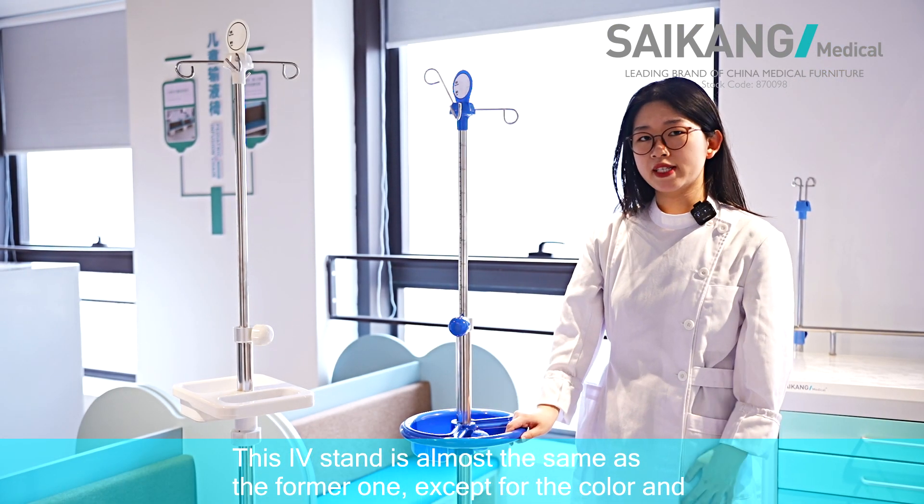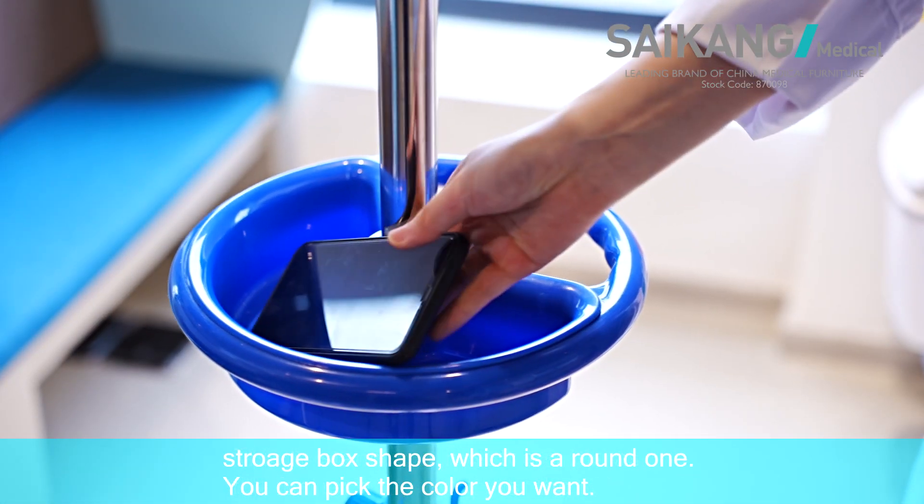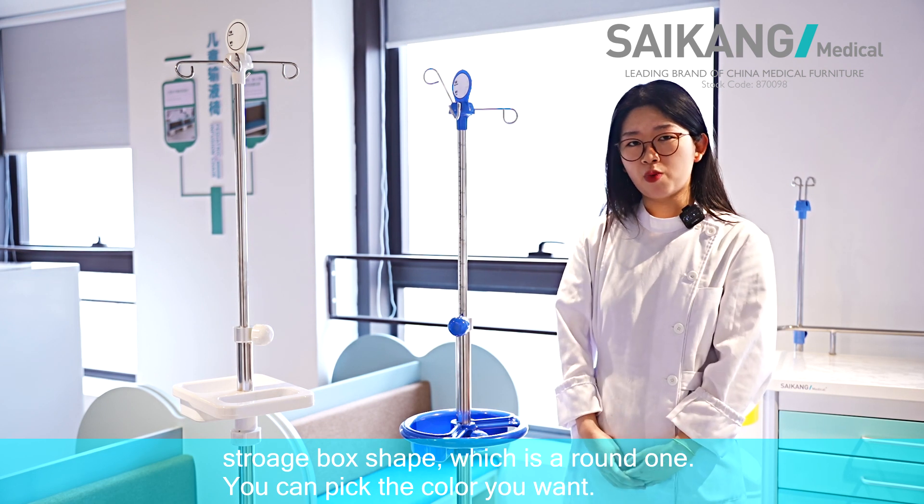This IV stand is almost the same as the former one, except for the color and the storage box shape, which is the round one. You can pick the color you want.